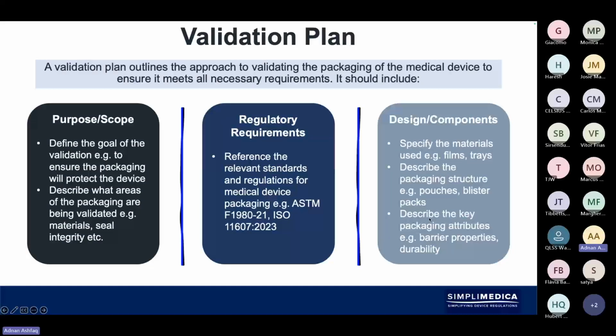So when you start thinking about writing up documentation for validation, you should always begin with a validation plan. Now, in the previous session, I discussed IQ, OQ, PQ, and the requirements of these different documents. I also touched upon the validation plan.